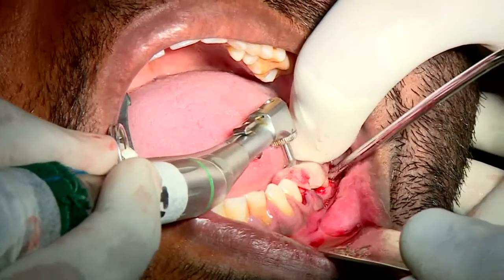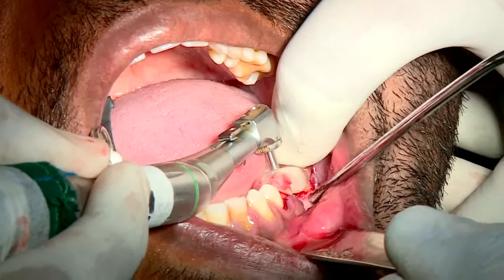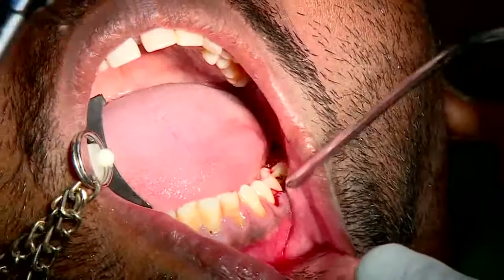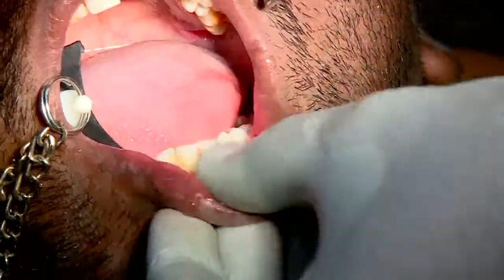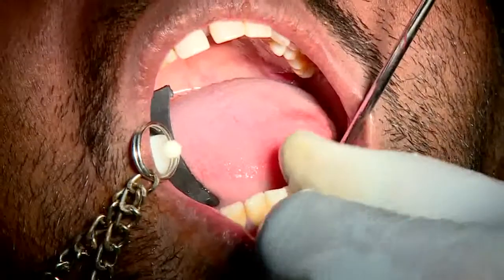Dr. Yasser, we are just marking the site of the bone. Yes, sir. I might have to use a drill extender here because we are talking about a fully bounded saddle here. Now I have marked my site where I want it. The most important thing in the first bit of this implant placement is the three-dimensional positioning of your drill.